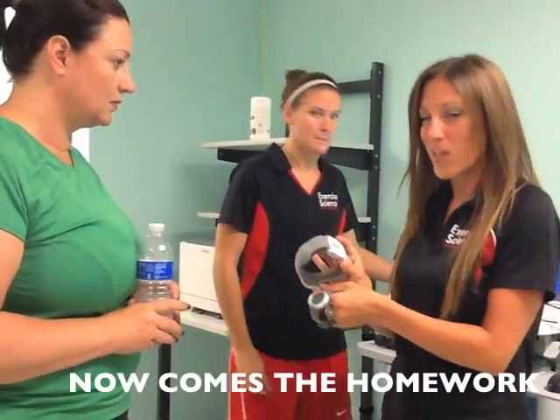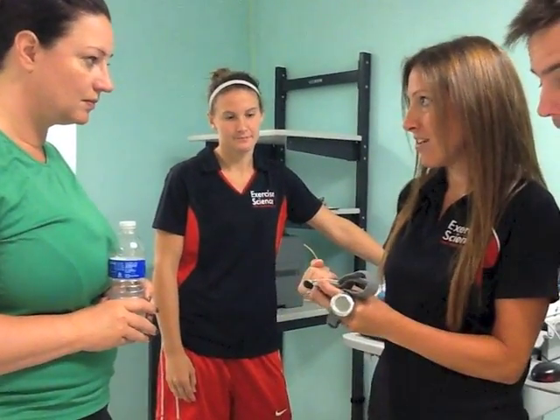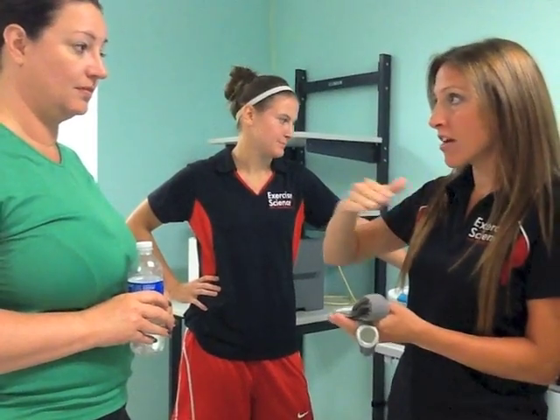This is the sensor arm band, and what it's going to measure is the number of steps that you're taking and the number of calories that you're burning per day. We're going to break it down into how much time and how many calories you spend sleeping, lying down, being sedentary, and being lightly, moderately, and very active.